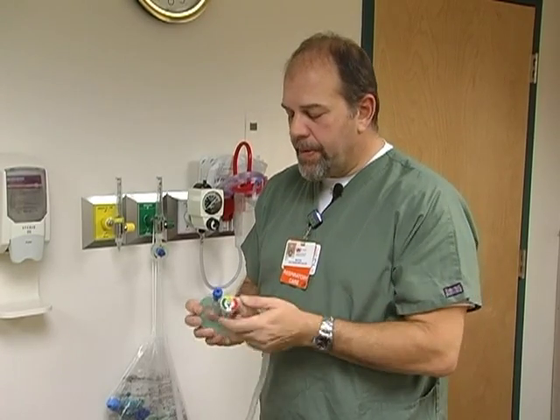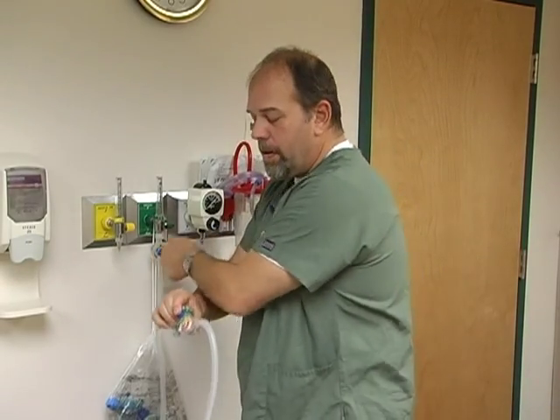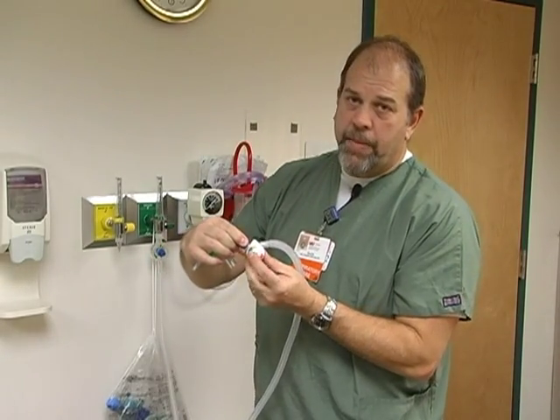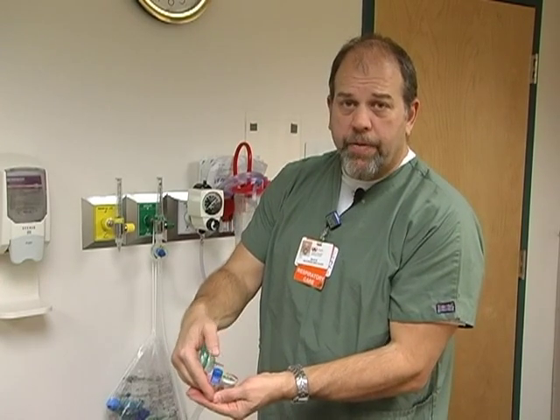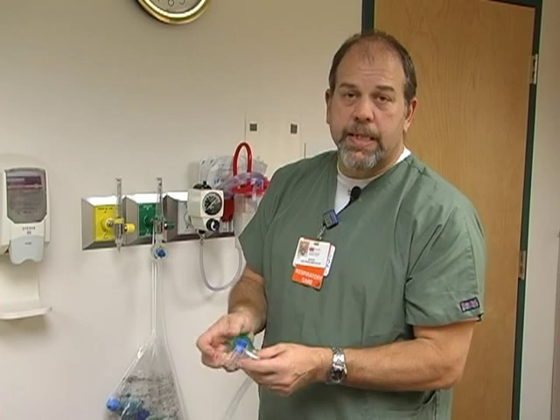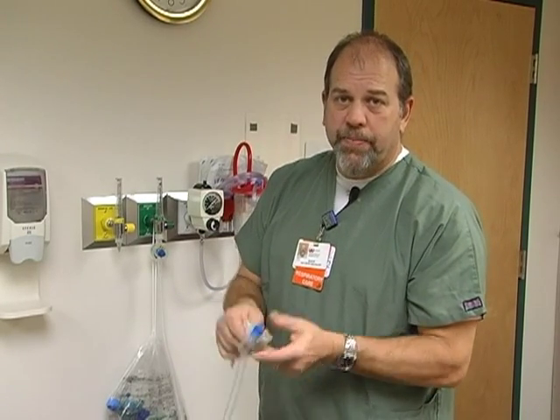Setting it again: occlude the T-piece and adjust back at the controller while watching your manometer right here. You're right there at the baby and can watch the manometer as you're delivering breaths. When you're ready, same as the Neo-Puff — you just cover the hole, give the breath, it delivers the pressure, and you're watching your pressure right there. And that's pretty much all there is to it.